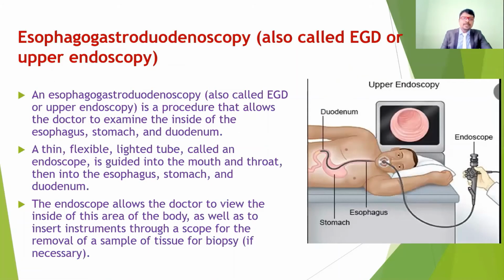The next one is esophagogastroduodenoscopy, also called upper endoscopy.